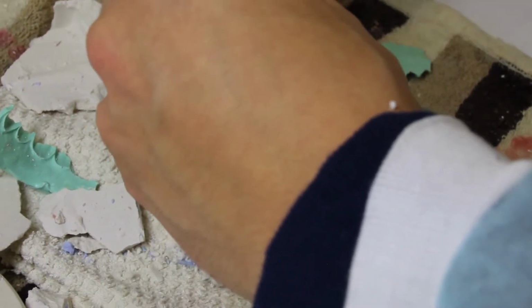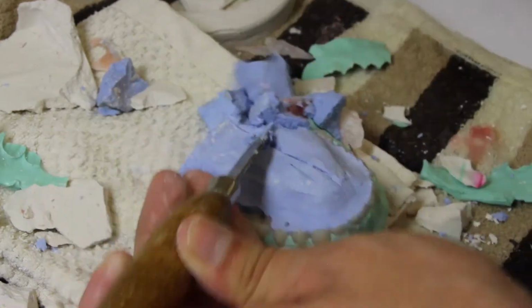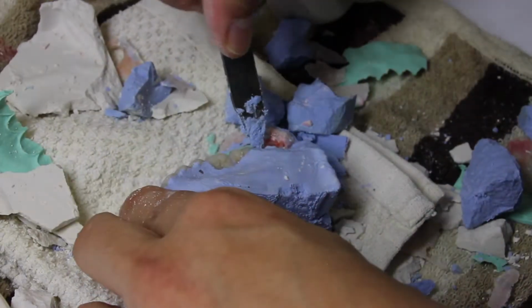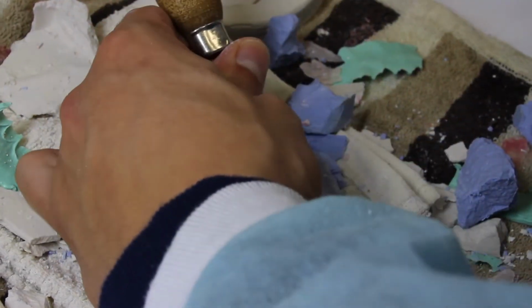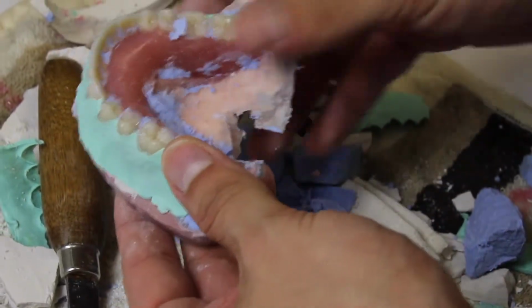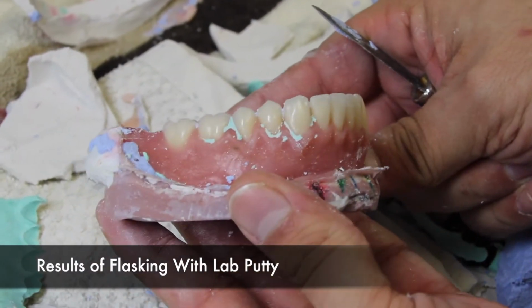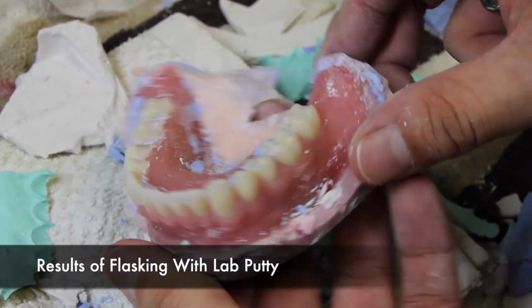If bisecting the investment stone in the tongue space does not dislodge the stone immediately, continue to section the stone. It will dislodge eventually. Once again, the use of laboratory putty during the flasking stages allows for a really accurate representation of the wax-up.